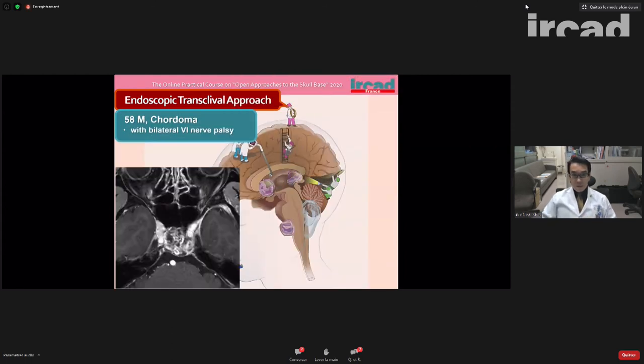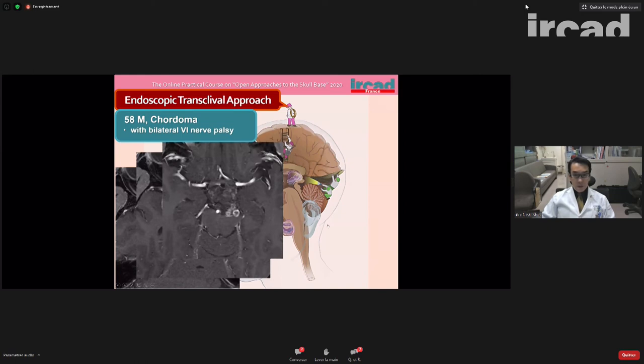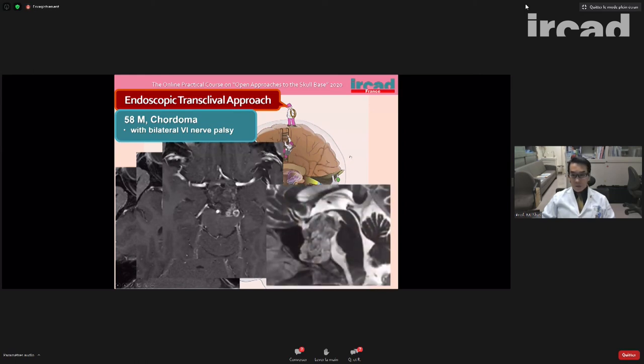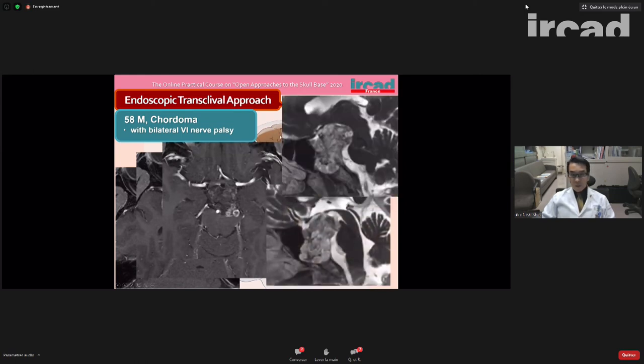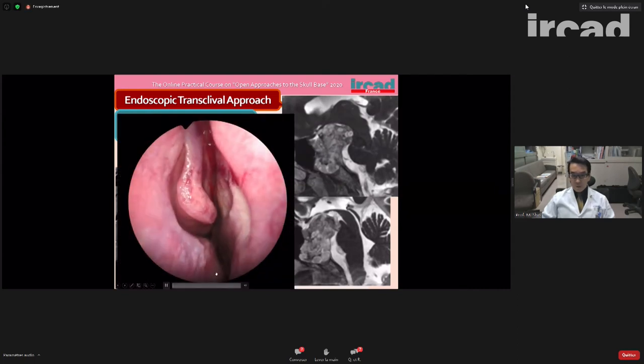I think this is the most similar case to this patient. Of course, in Japan, we don't have many large cases. The tumor is often very modest, but it's invading into the basal system like this. And in this case, I performed the same procedure.